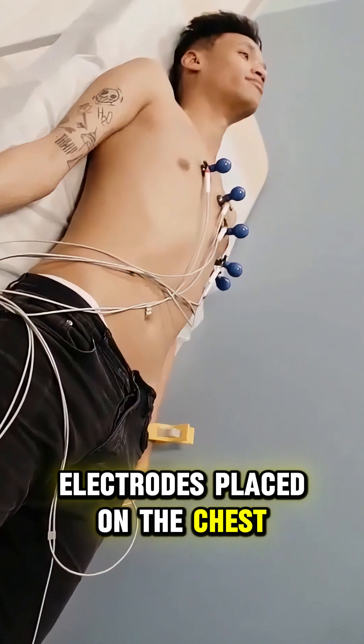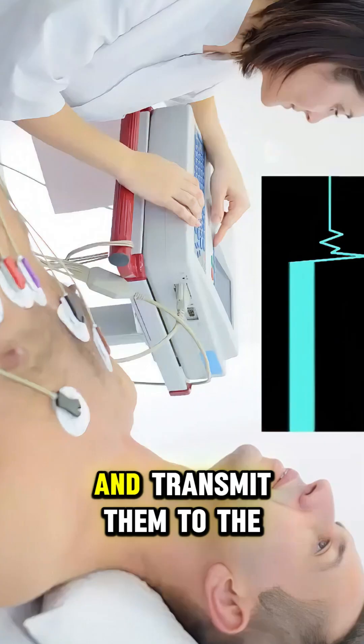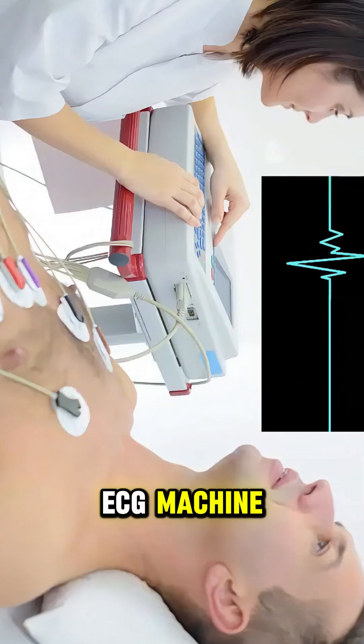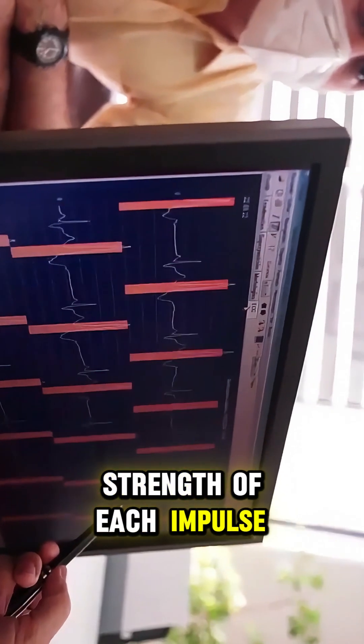Electrodes placed on the chest, arms, and legs detect these signals and transmit them to the ECG machine, which records the timing and strength of each impulse.